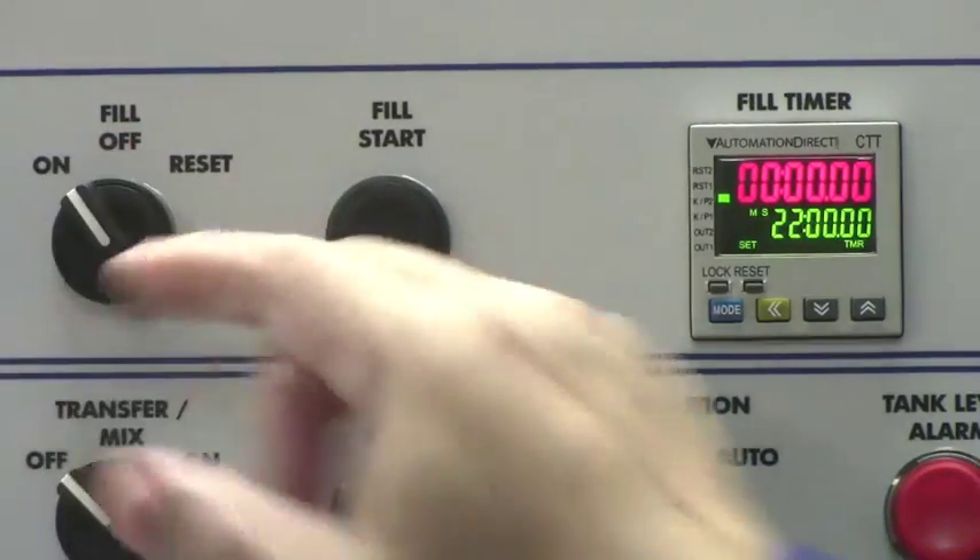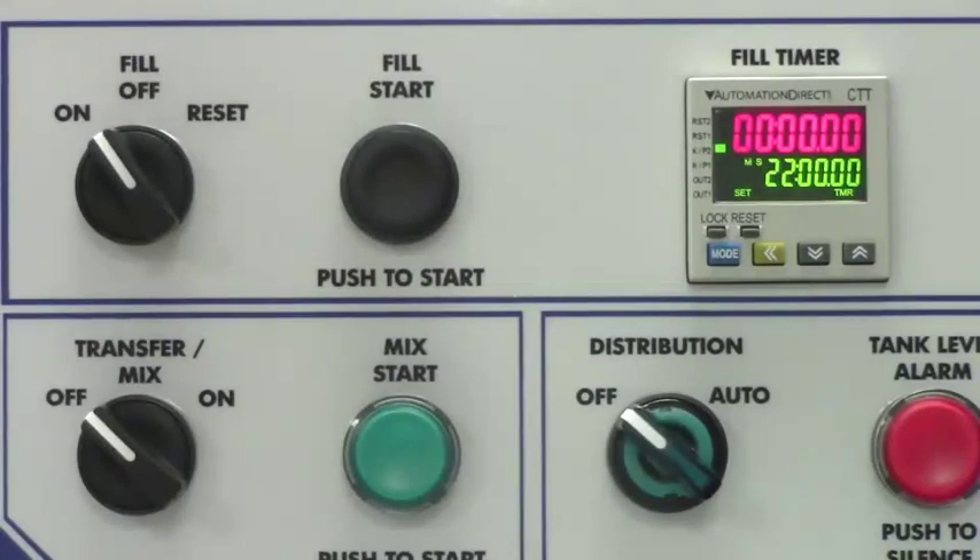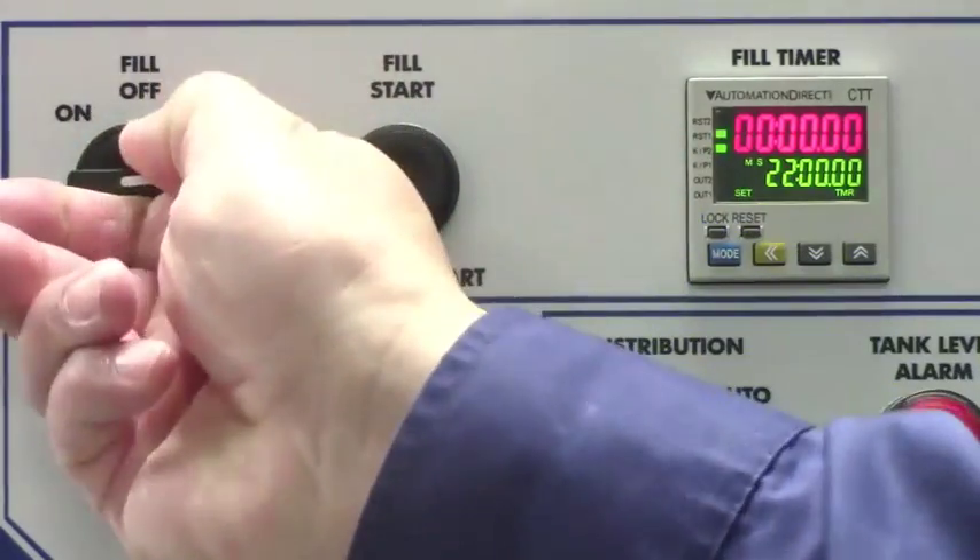Turn the fill switch on and push the fill start button. After the mix tank is filled, turn the fill switch to reset.